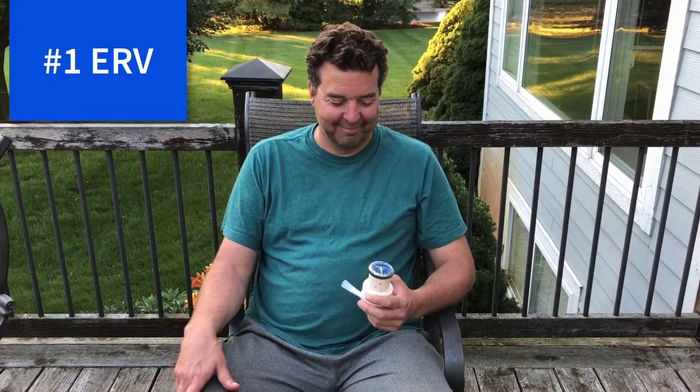Okay, so here's Chris, and we're going to do trial number one. Take two. We're going to do trial number one for expiratory reserve volume. So we're going to do our normal tidal breathing. And at the bottom of normal breathing, so you're not actually making an effort to breathe out, you're just letting go. Okay. Then you're going to push out. Okay, ready? Go ahead.